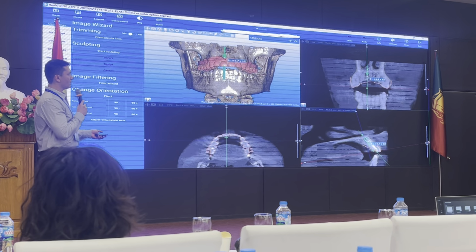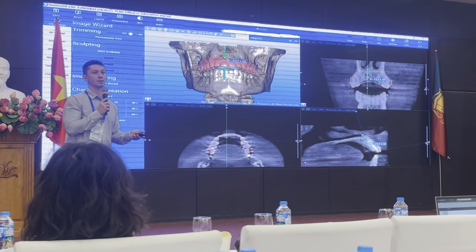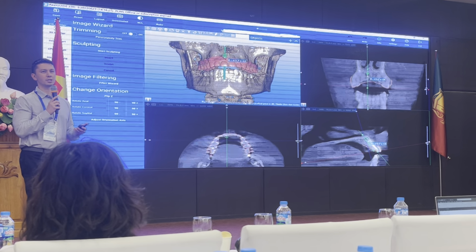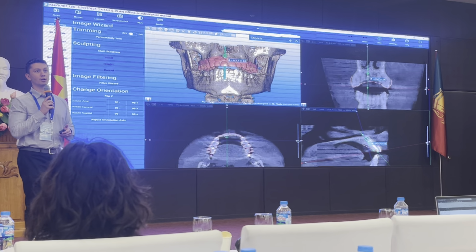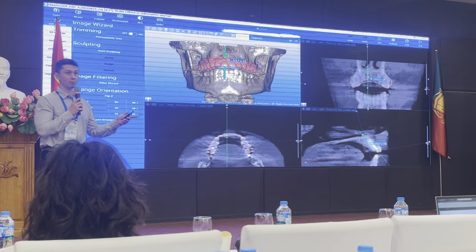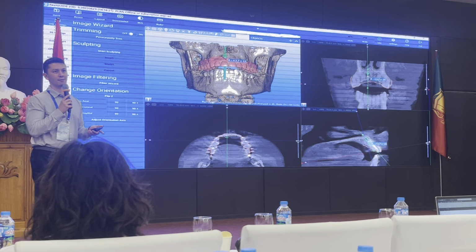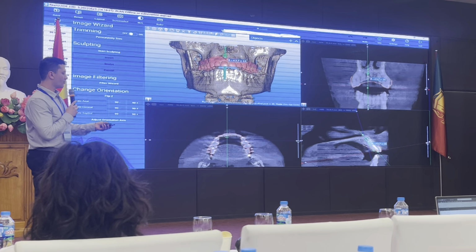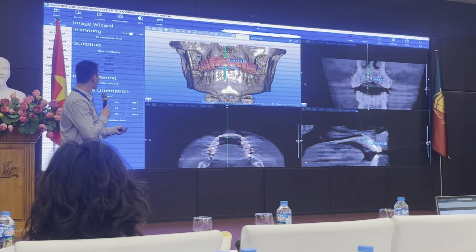A lot of these things that we're showing today, like what Dr. Kim and Doug were showing earlier, make dentistry more efficient, predictable, and safe. Sometimes that means we can go faster on surgery, meaning a faster appointment, but we're not interested in fast dentistry, we're interested in safe dentistry. So in this case, we were able to place an implant with the bone that was remaining at the apex of that central incisor.